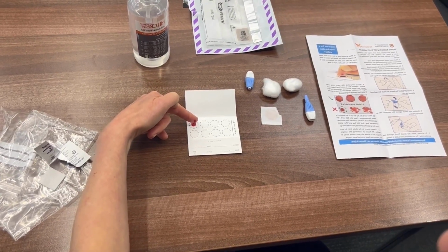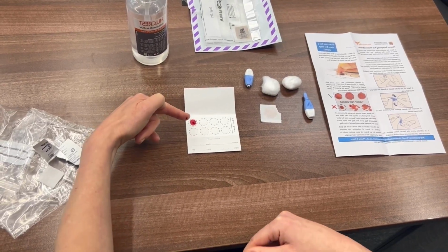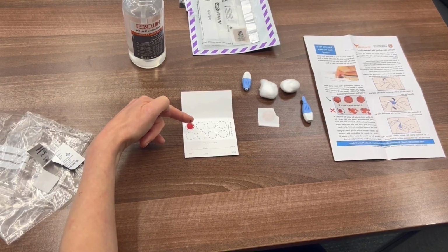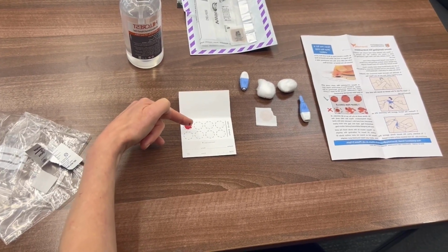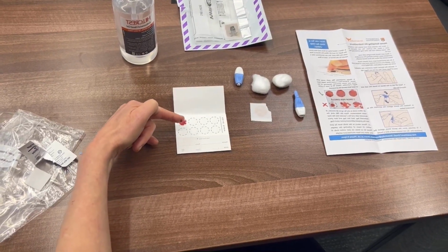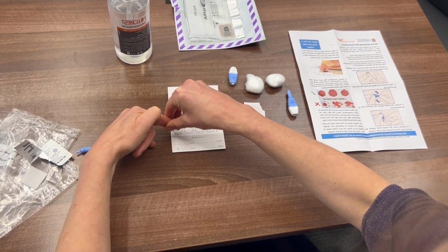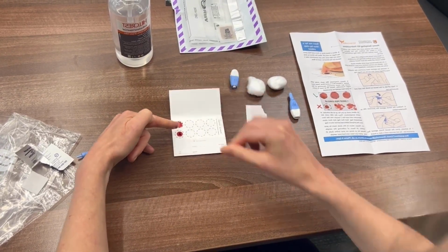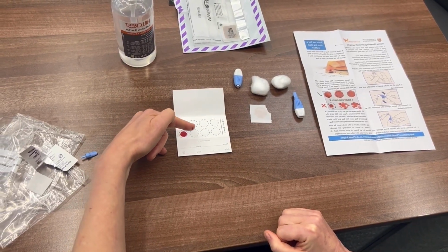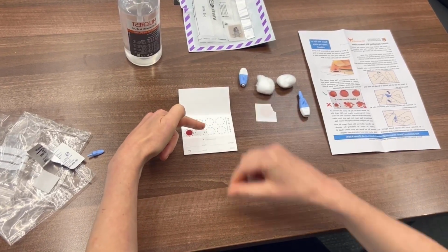So it's really important that we put another spot on there. This is so that I know the total amount of blood is what we are expecting. So that spot is now full. There are examples in the paper instructions where it isn't full, and if it isn't full, then it's too difficult to accurately measure your antibody test.